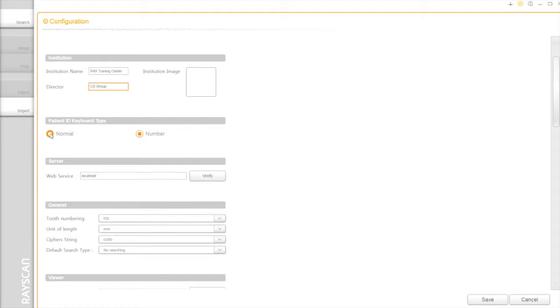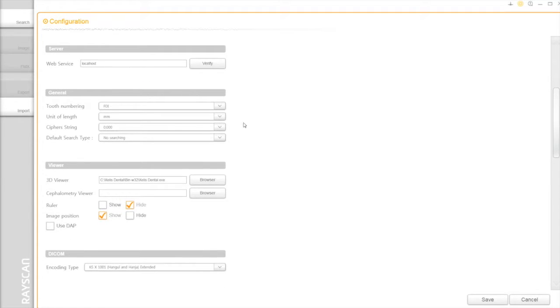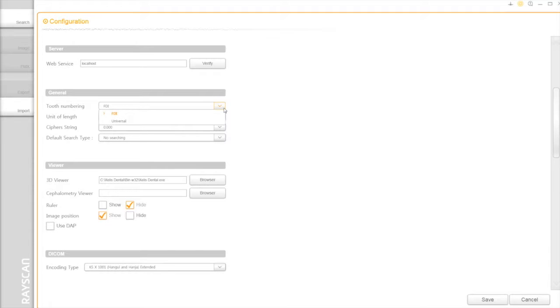SmartDent provides the user two kinds of keyboards. On General Option, you can choose either FDI or Universal as your preference.